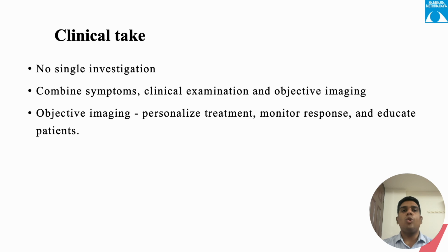To summarize, no single investigation diagnoses all forms of dry eye. Combine symptoms, clinical examination, and objective imaging for accurate diagnosis. Objective imaging helps us to personalize treatment, monitor response, and educate the patients.